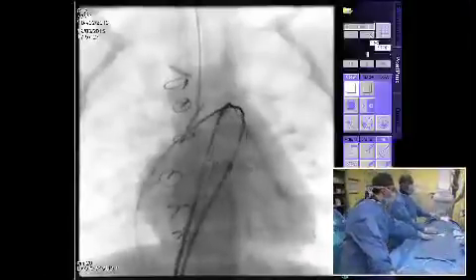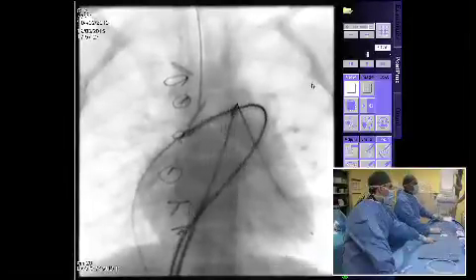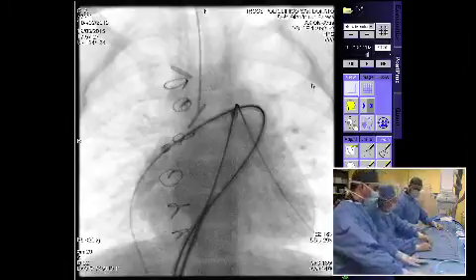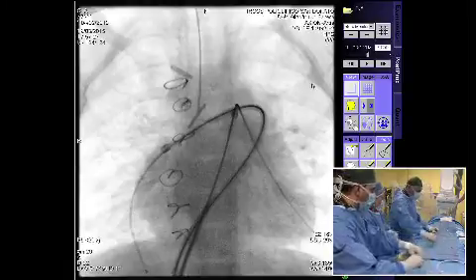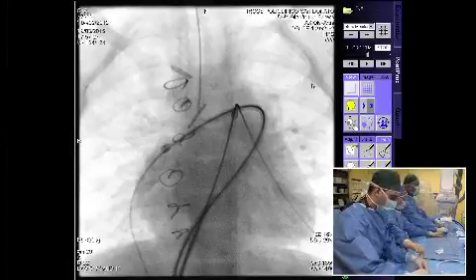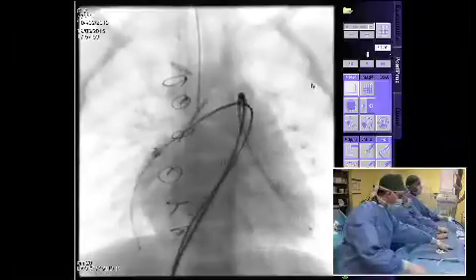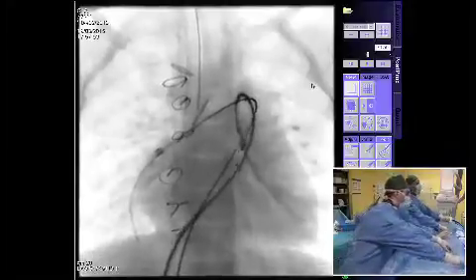You may go live now. We are advancing the right Mullins sheath. We are quite far, so please retrieve the dilator. Lucienne is helping me in a wonderful way, and also Luca. And now we advance the dilator and the Mullins sheath on the left side. Any comment about the length, diameter of the stents to be used? Any experience about Valeo stents or other options? Nobody getting up for now. Comments?